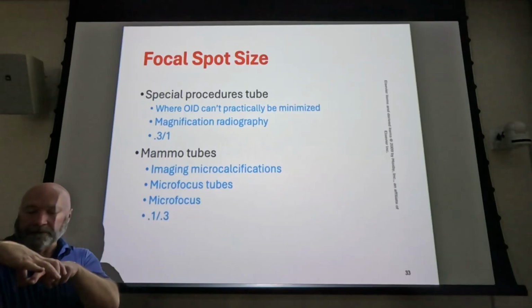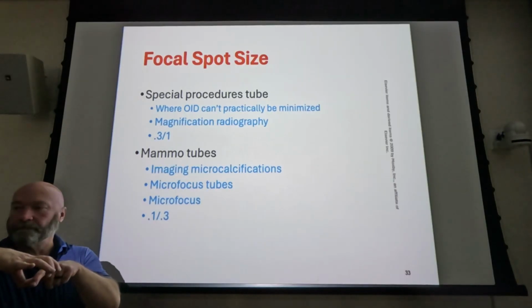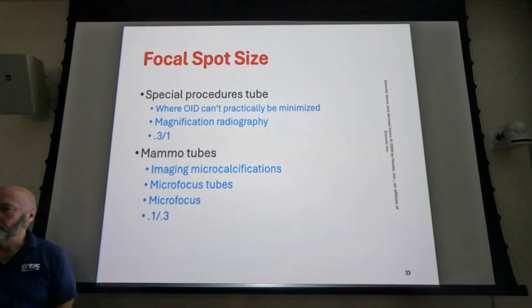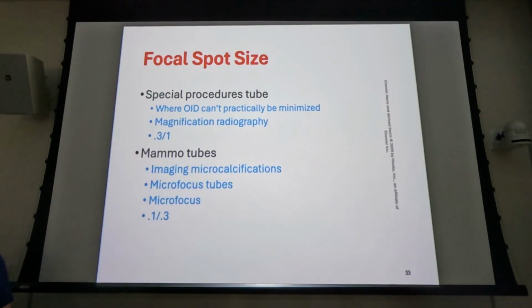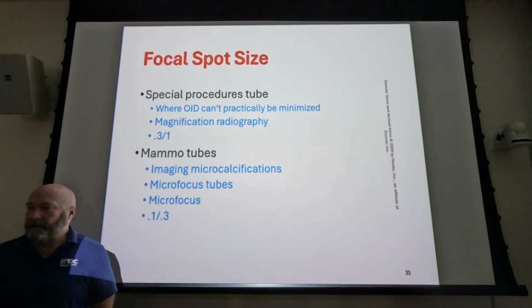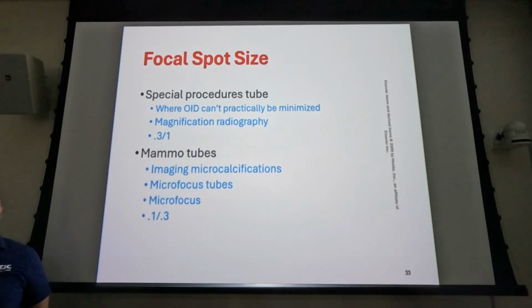Now when they go to a lateral, they're not lined up, right? They don't want to do that. So it's an intentional increase in OID without an increase in SID. It's macro radiography. Originally, the purpose for that was two. One was what I just talked about. Two was to increase the size of the image. Does it still increase the ratio of magnification?